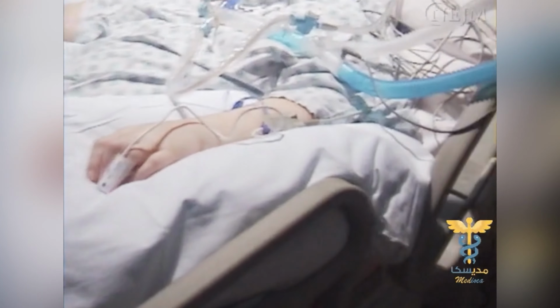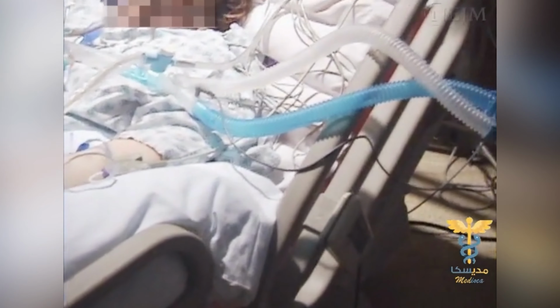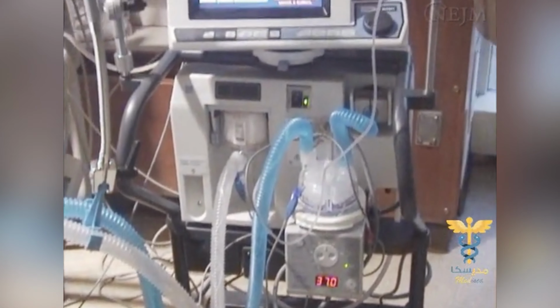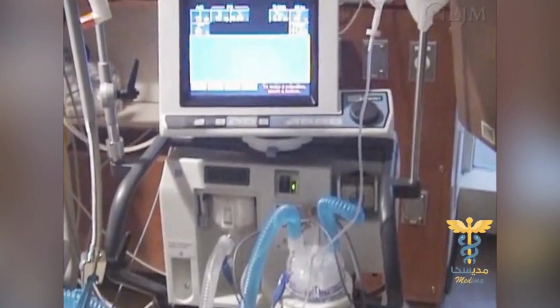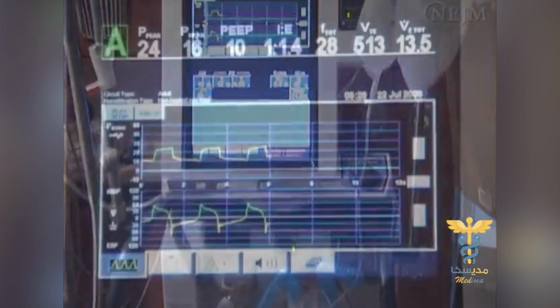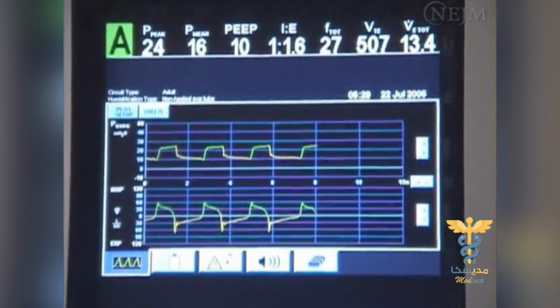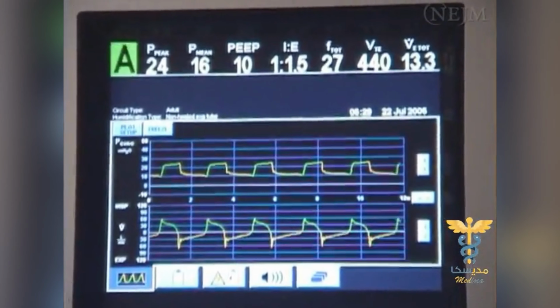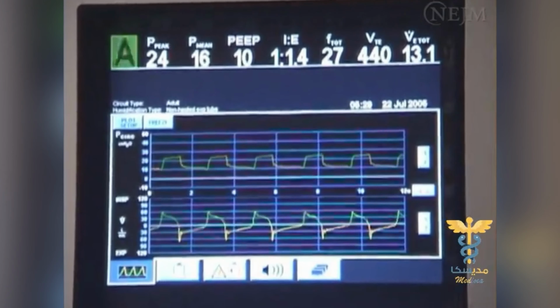The procedure should be used with care in patients who are receiving mechanical ventilation, since positive pressure ventilation may bring the lung close to the thoracentesis needle and increase the risk of pneumothorax. Thoracentesis should be deferred in patients with severe hemodynamic or respiratory compromise until the underlying condition can be stabilized.